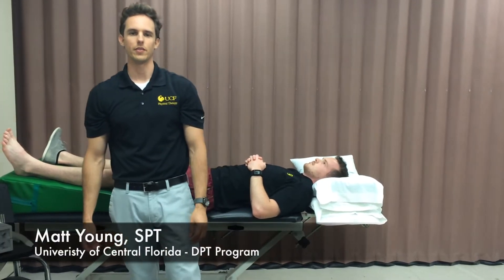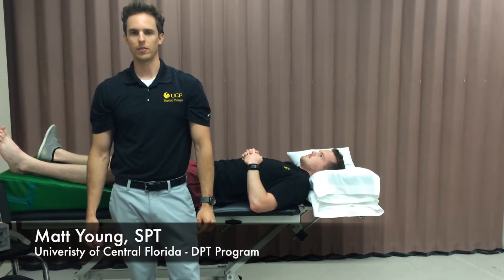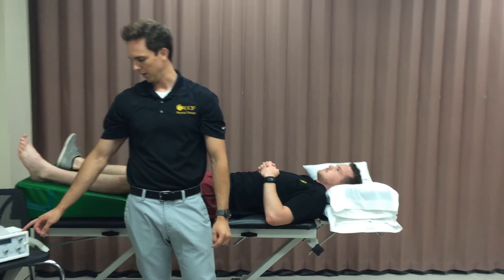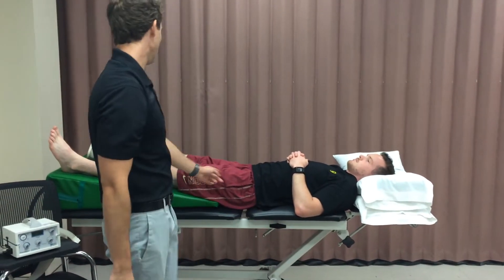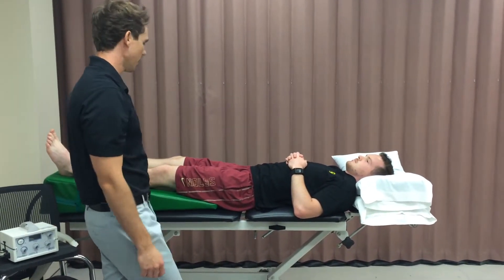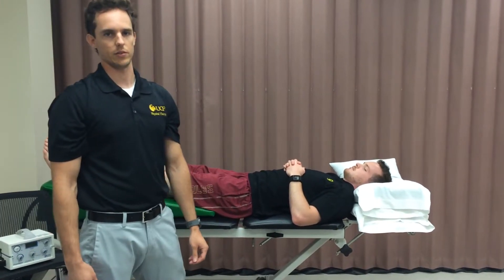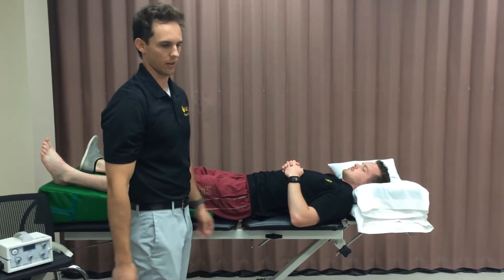Hi, my name is Matt Young with UCF Physical Therapy. Today we're going to demonstrate a modality used for compression. We're going to be using intermittent pneumatic compression on our patient who is a post-op left hip fracture, so he just had surgery. We're basically using the compression device to prevent any deep vein thrombosis associated with the edema in this left leg.